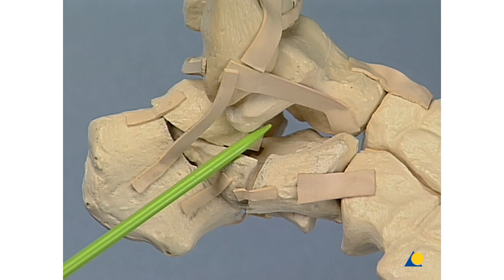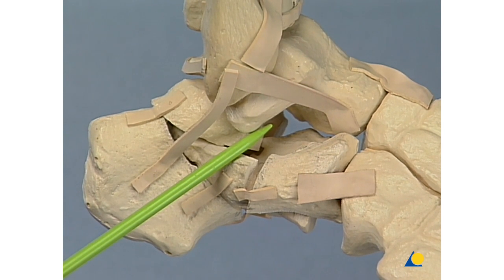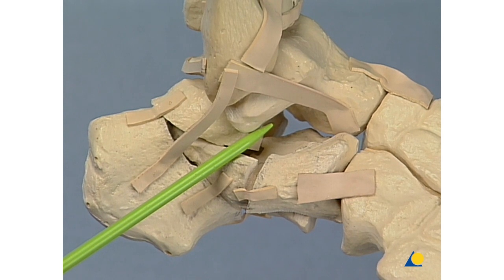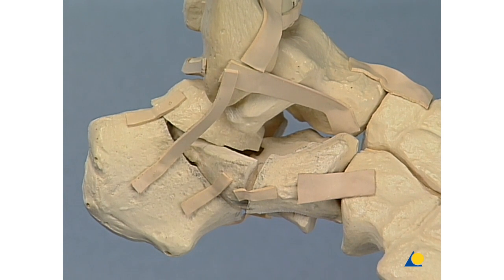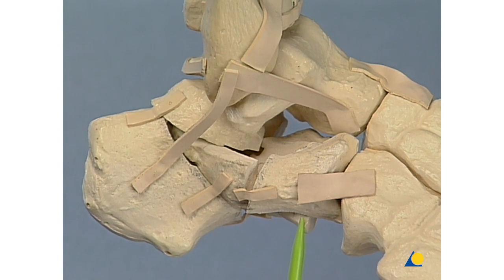The fourth is a medial joint-bearing fragment comprising part of the posterior facet in the sustentalculum of the tali. The fifth is an anterior lateral joint-bearing fragment of the calcaneal cuboid joint. And finally, the medial portion of the anterior calcaneal process, also joint-bearing corresponding to the calcaneal cuboid joint. This sixth one is also displaced.